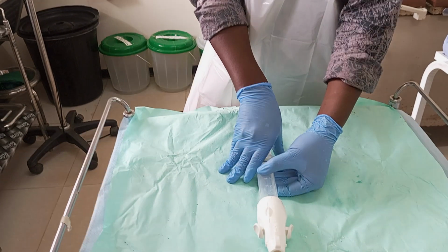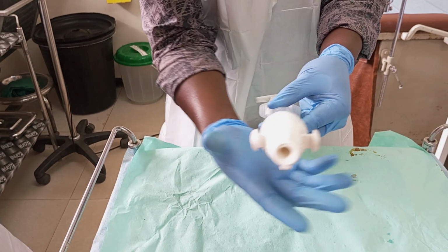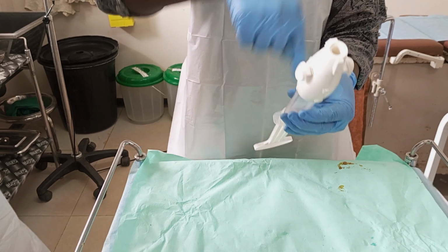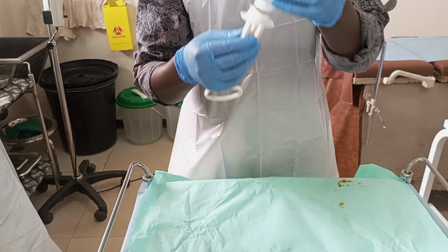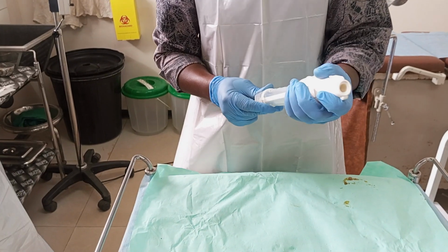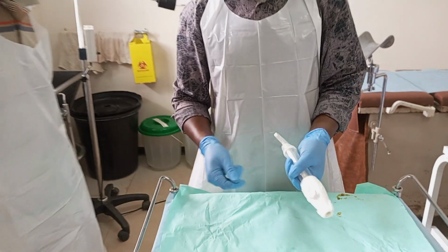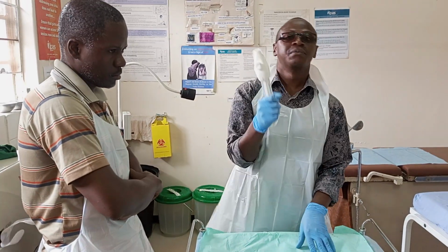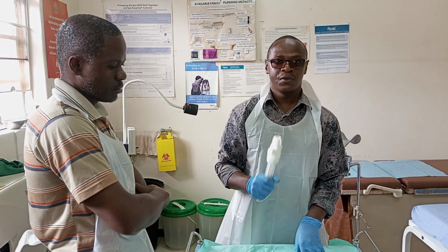How do we know that we have achieved the vacuum in there? We simply press the button. You can hear the sound of rushing air into the cylinder. That's the confirmation that it is able to charge, meaning it is now ready to be used on the patient. The moment you discover that it's unable to maintain the vacuum, please look for another gadget. Never prepare a patient and then, before you start, find that the gadget is not working. It's better you test that in advance before using it on the patient.